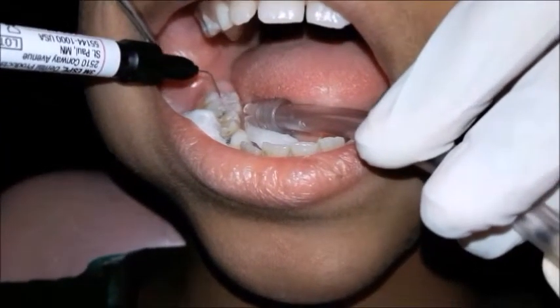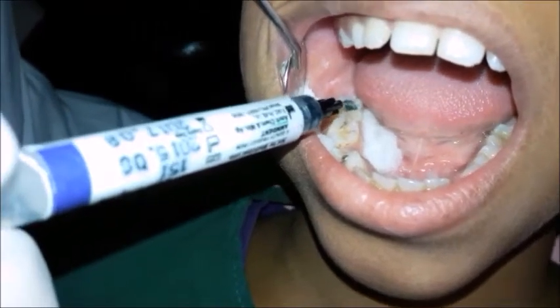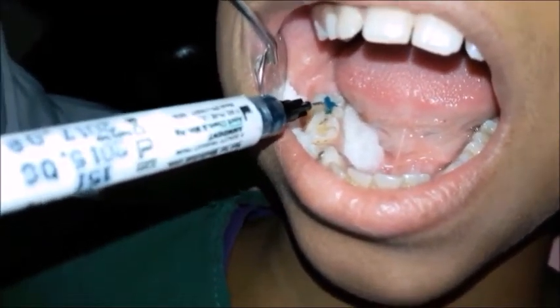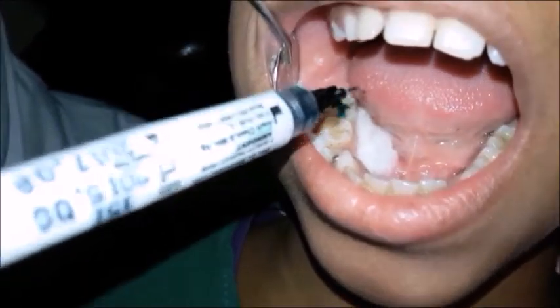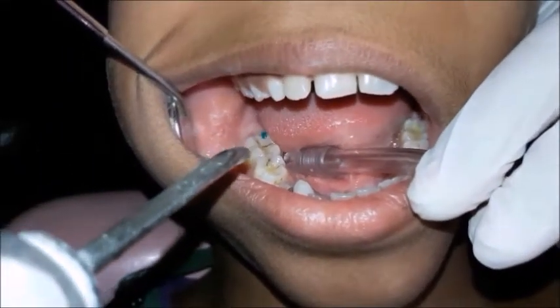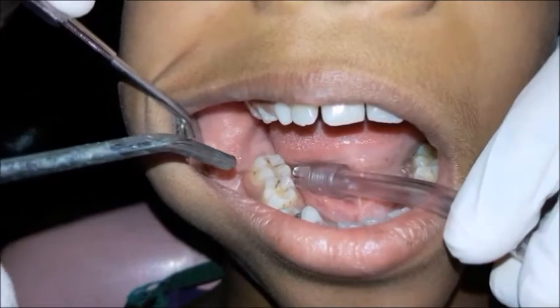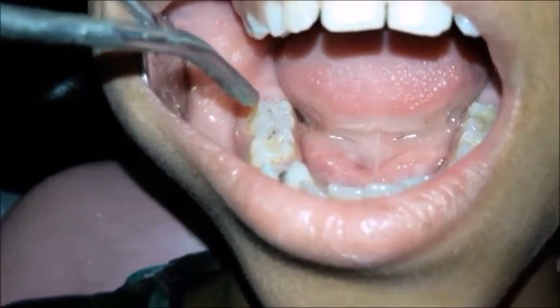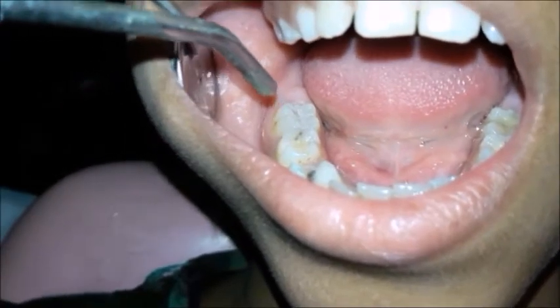The tooth is then etched with 37% orthophosphoric acid. The etching time is 15 to 30 seconds for permanent teeth. The tooth is rinsed with water and air dried with a three-way syringe. The frosted white enamel surface indicates adequate etching.